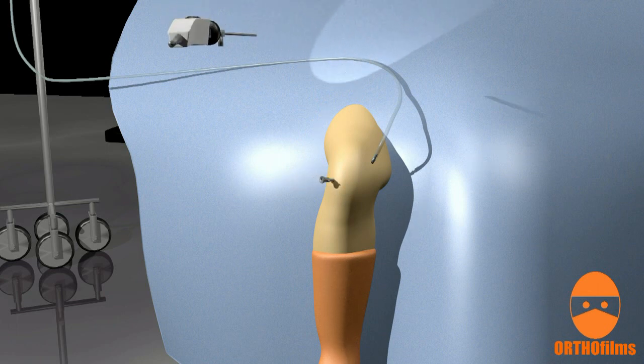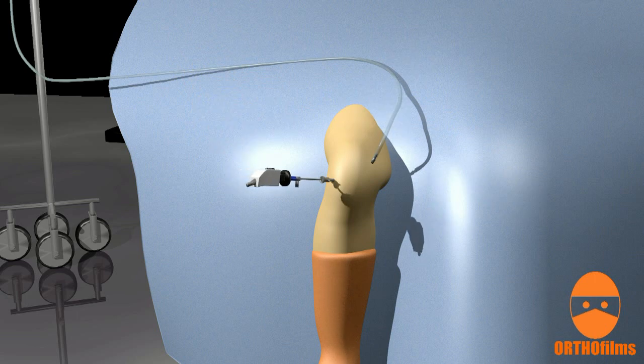Once the camera is inside the knee joint, the structures of the knee can be inspected.